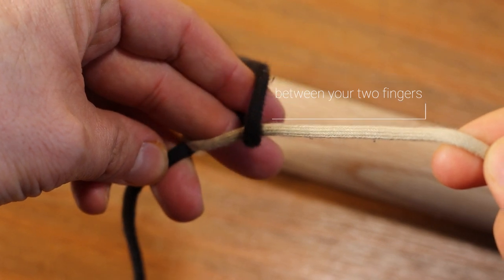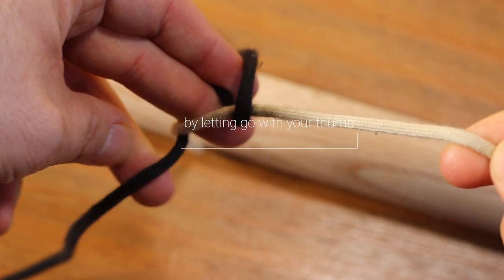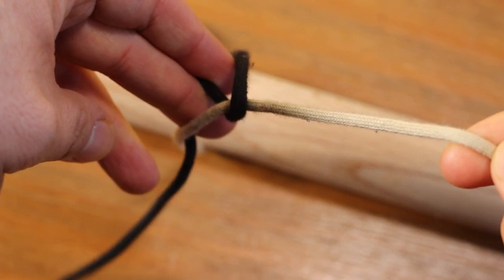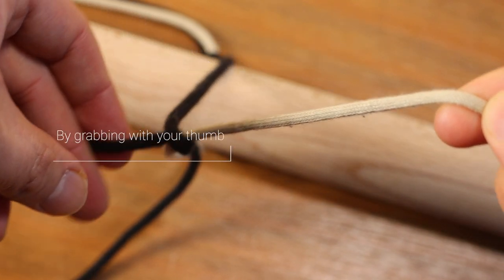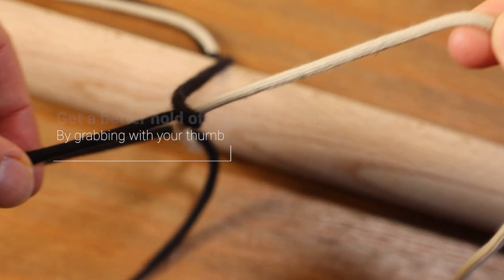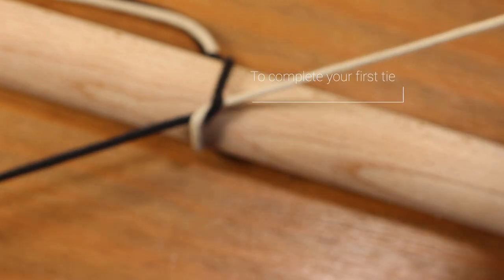Now between the index and the second finger, you're going to grab the black string and then at the same time release the black string with your thumb and fourth finger. Now you can continue pulling with the index and second finger and get a better grip by using your thumb a little bit later. Now all you have to do is pull the two strings and tie down the knot.